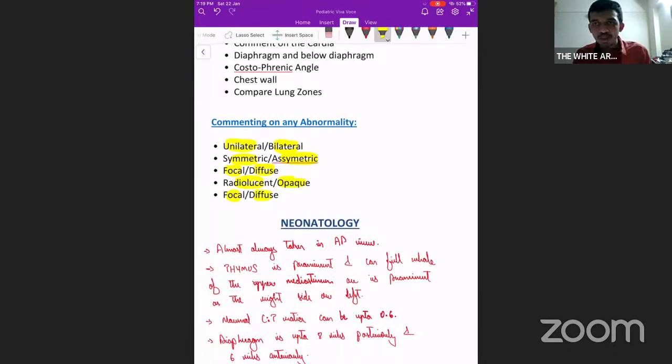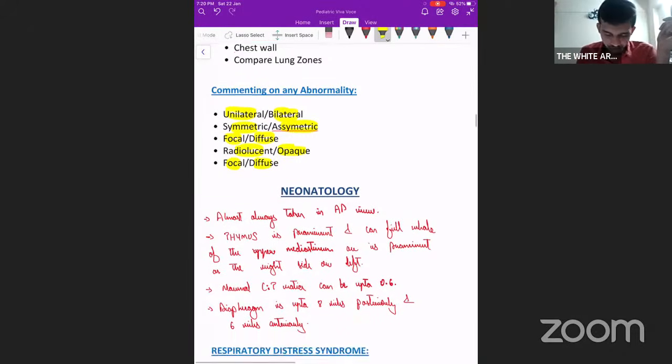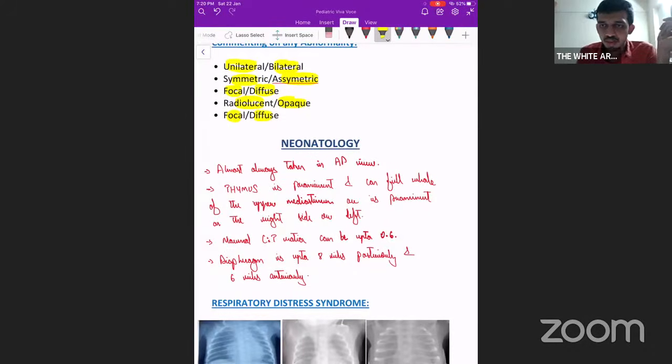Centering of the X-ray means whether it is placed in the center or whether it is moved off into one of the corners. Okay, that's all it means. Any other doubts on YouTube or on Zoom, or can we go ahead to the next topic? No, it is not the same as rotation. Rotation is from the intervertebral space midline to the clavicle. Centering means the whole film as it is can get pushed off into one side, correct? That is the difference between centering and rotation.